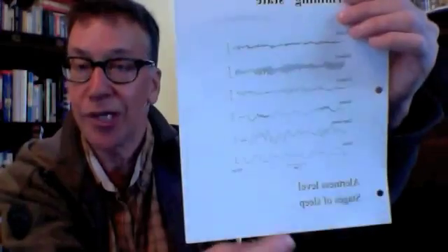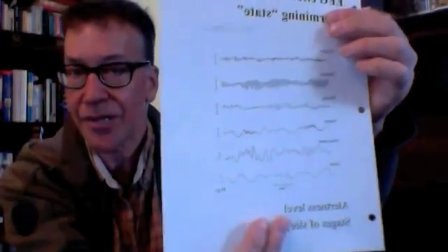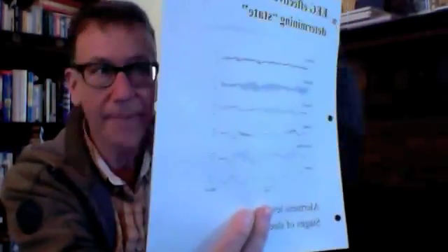You're not processing nearly as much information as when you are awake and engaged, where different little subsets of neurons are processing different aspects of your experience. If you're in a coma, it's really high amplitude, really slow. Nothing is really being processed at all at that stage, at least from the cortex.